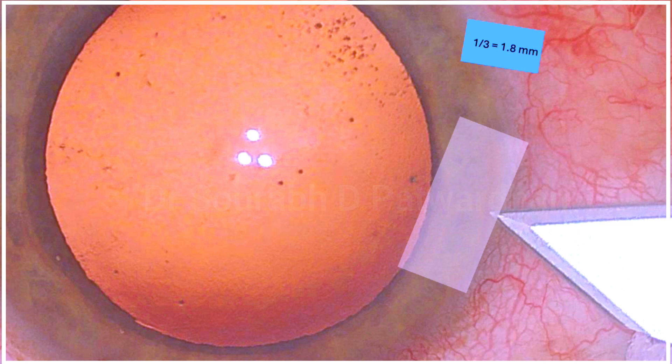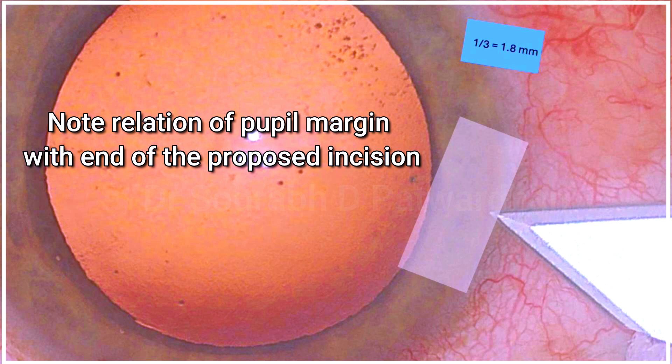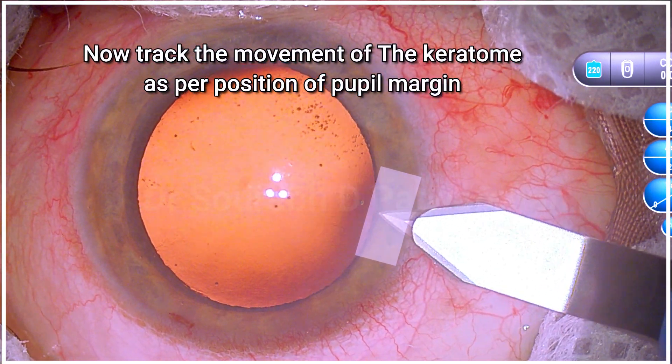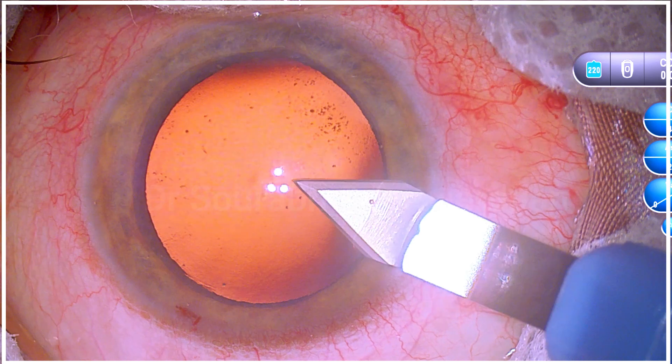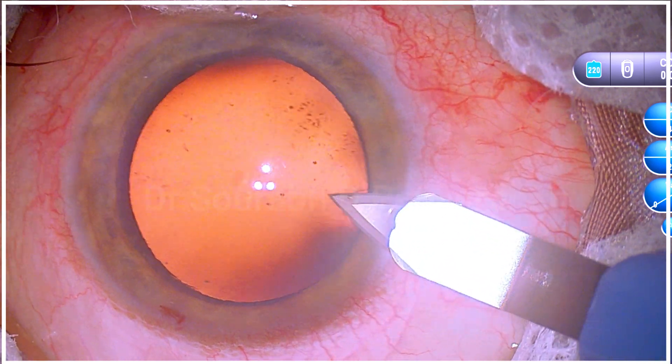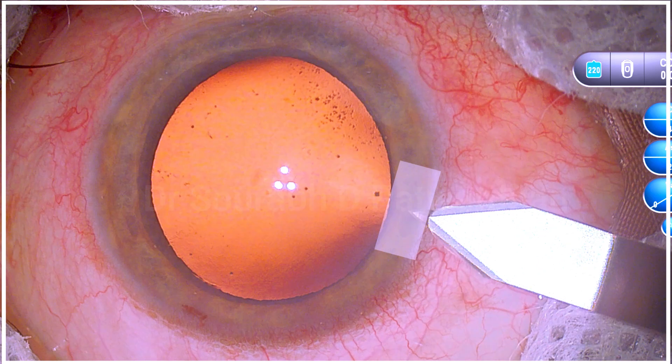I don't want it too long because maneuvering will be difficult and there will be hydration of the incision. I want perfectly 1.5 to 1.8mm length of the incision. So now I am noting the relation of the pupillary margin with the end of the incision I am seeking, and I am tracking the movement of the keratome according to the pupillary margin.